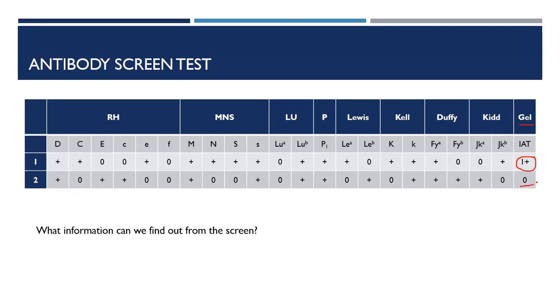Are we dealing with multiple alloantibodies? We do have, again, limited information, but we can at this point presumptively rule out an autoantibody for the reasons that I explained before. We do have a negative reaction, and most of the time when you have an autoantibody present, that's going to cause you to have pan-agglutination reactivity, or antibody reactivity with all screen and panel cells.